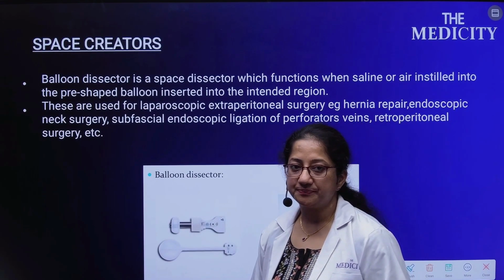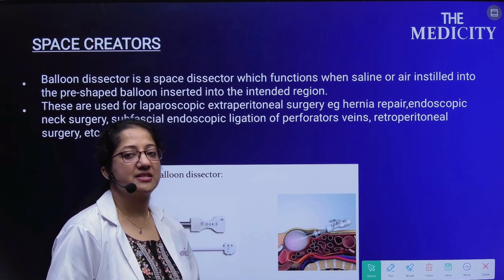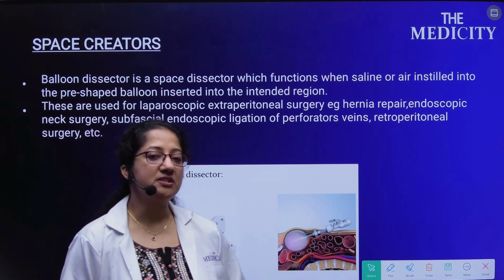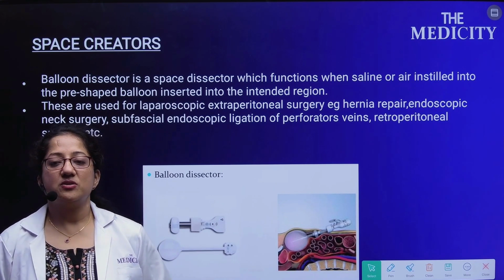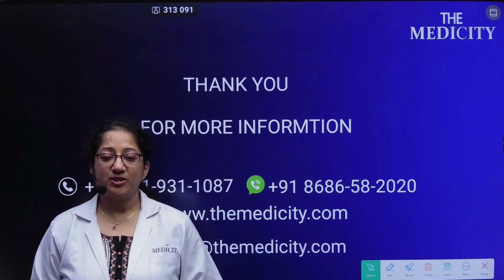Space creators, balloon dissectors, are space dissectors where saline or air is instilled into the pre-shaped balloon inserted. These are used for laparoscopic extraperitoneal surgeries like hernia, endoscopic neck surgery, subfascial endoscopic ligation of the perforators, or the retroperitoneal surgeries.